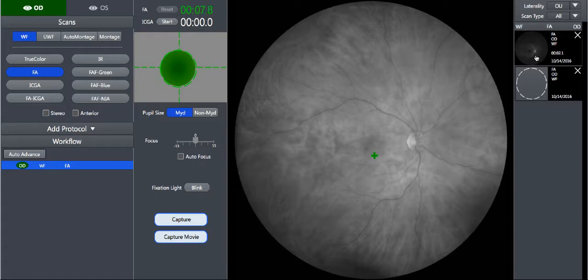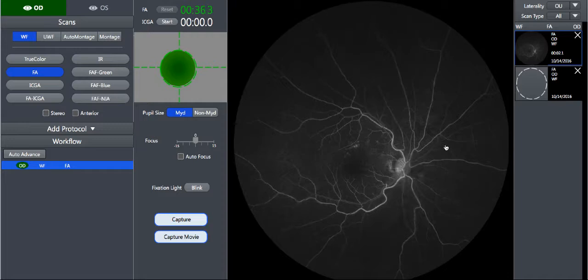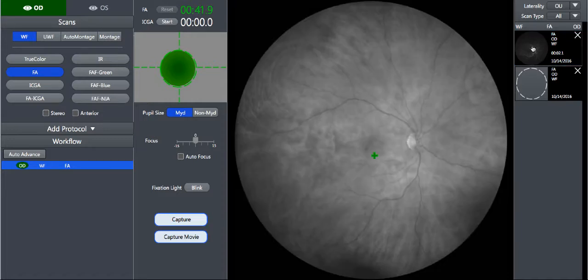For other image types, after the image is captured, it would show up in the main window for 3 seconds before the window reverts to the live image. This serves as a quick quality check to let the doctor know if he or she needs to recapture that image. However, for fluorescein angiography, because so many images need to be acquired in quick succession and the flow of the dye makes the recapture impossible, the quality check is disabled. But at any point during the process, I can click on any thumbnail and that image will show up in the main view until I toggle it off by clicking on the same thumbnail again. But my timer is running, so I'd better capture some images.